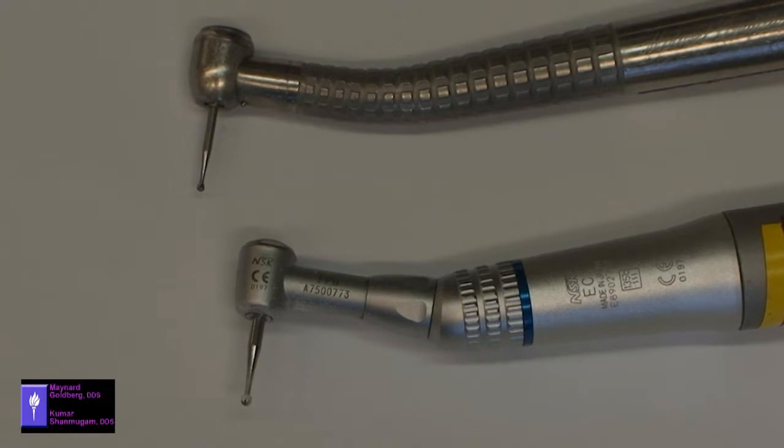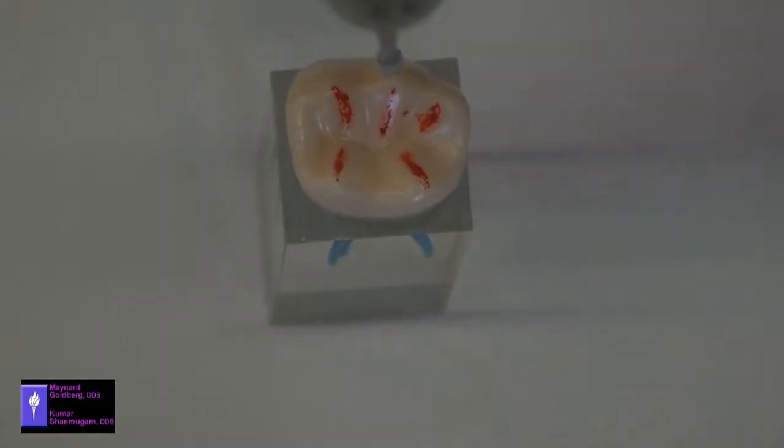There is a higher risk of perforating the floor of the chamber than with a slow speed handpiece. Therefore, you can use high speed to penetrate the enamel, the dentin, and the roof of the chamber, after which you will switch to a slow speed handpiece to finish up the access cavity.